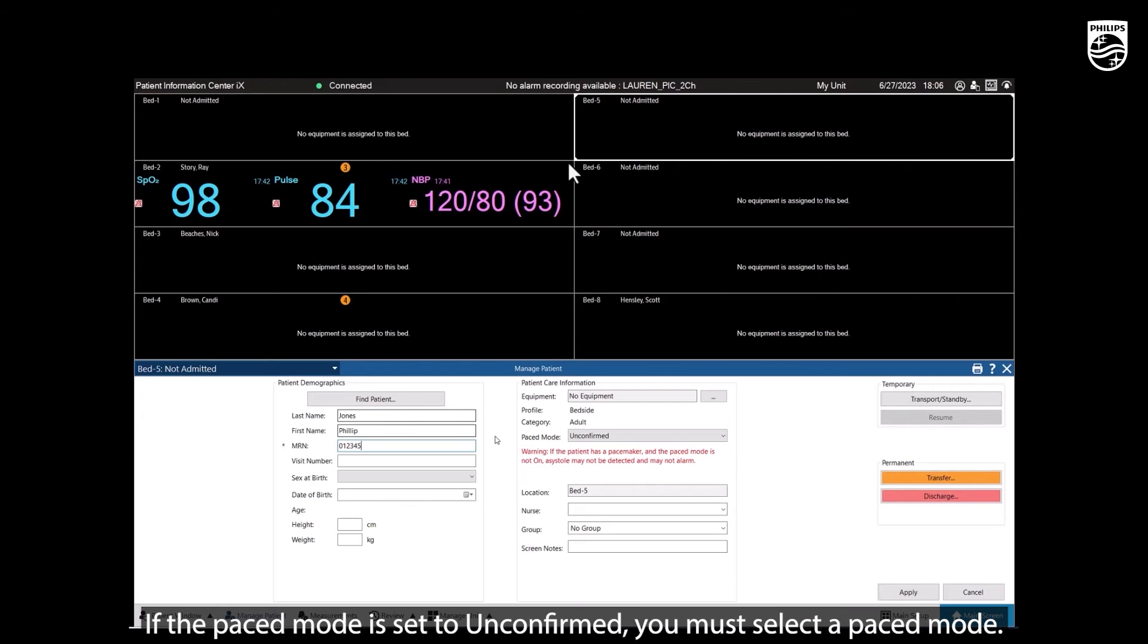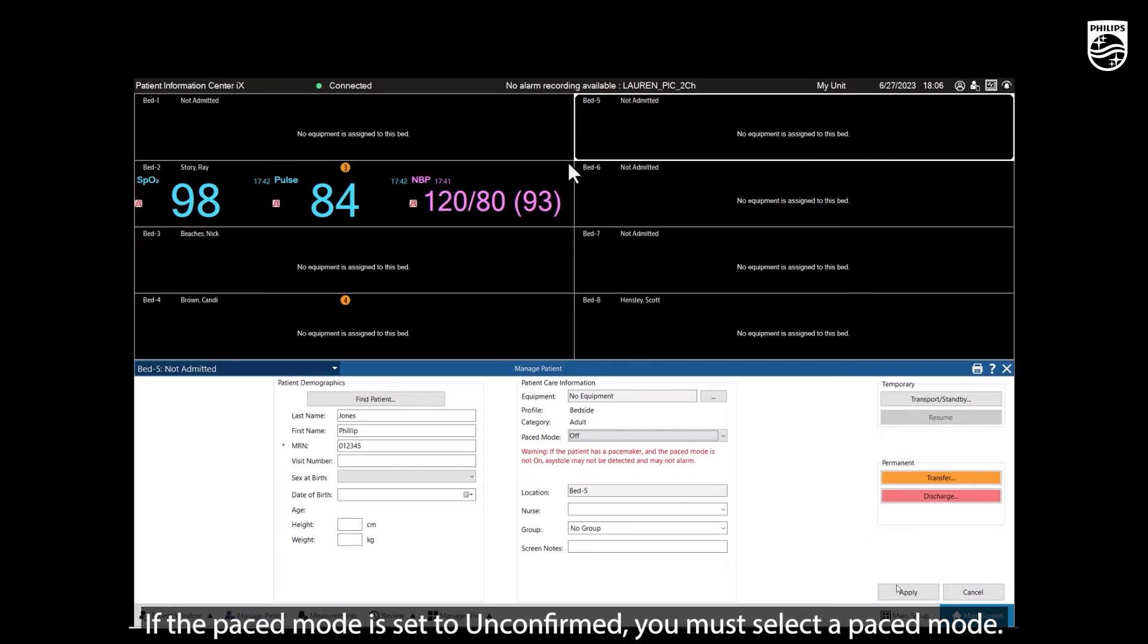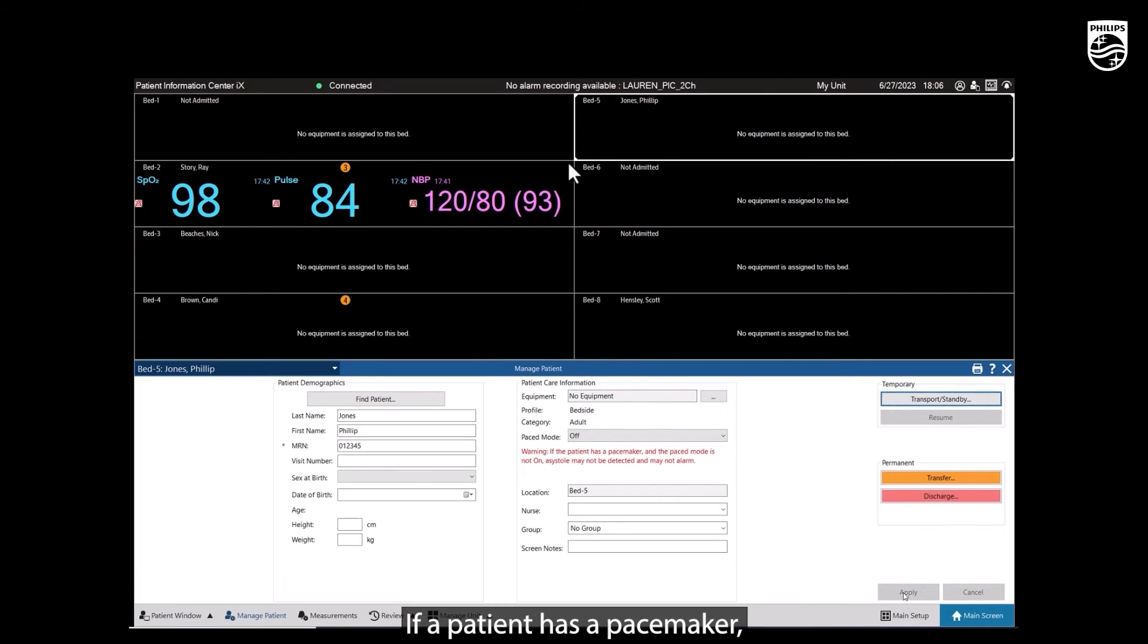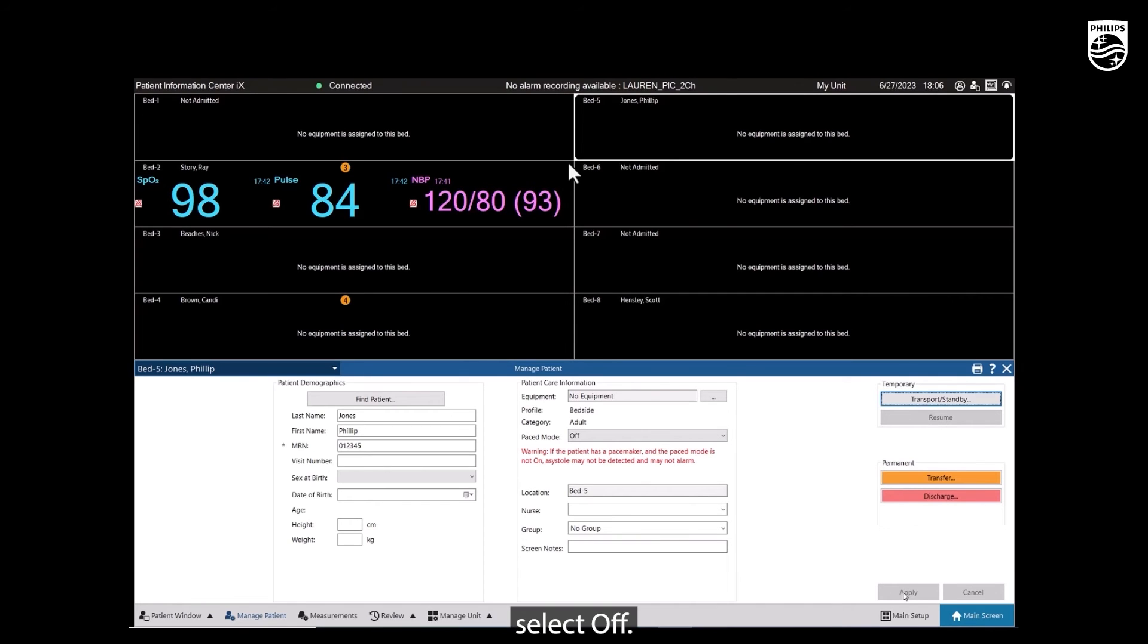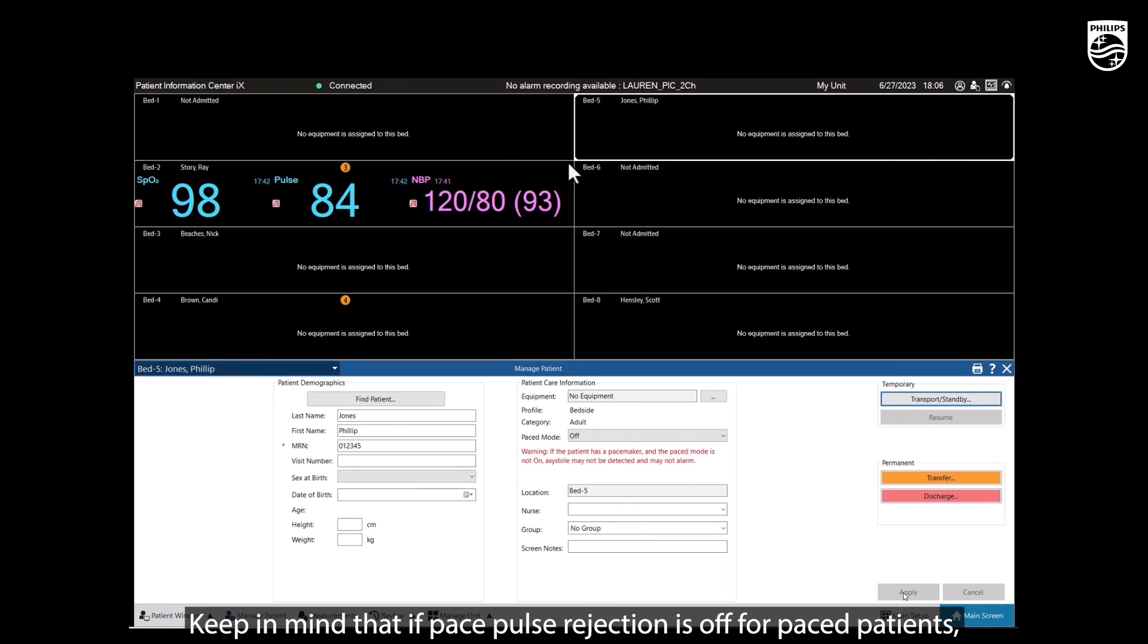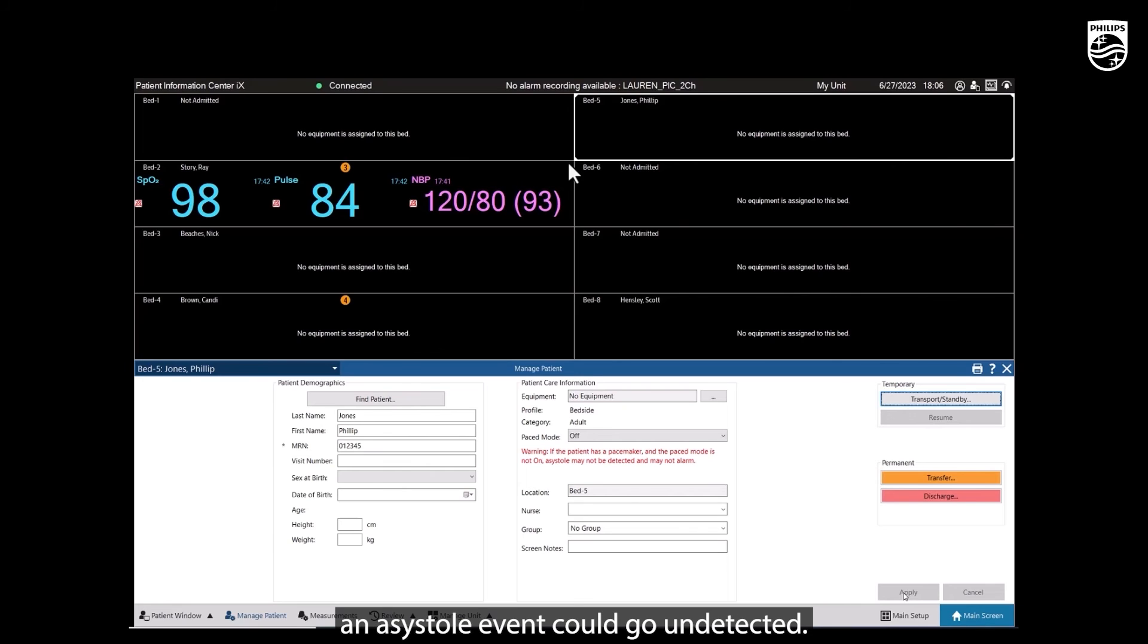If the pace mode is set to unconfirmed, you must select a pace mode. If a patient has a pacemaker, the pace mode must be turned on. If the patient does not have a pacemaker, select off. Keep in mind that if pace pulse rejection is off for pace patients, an asystole event could go undetected.